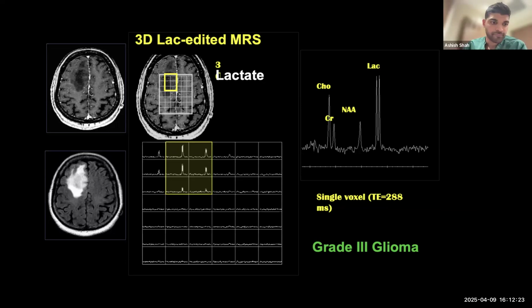Thank you for the wonderful talk. I had a question with regards to the sensitivity of your DCE and ASL in terms of diagnosing a lesion, say progression versus pseudoprogression. How often do you have to go to MR spec to confirm your diagnosis there?